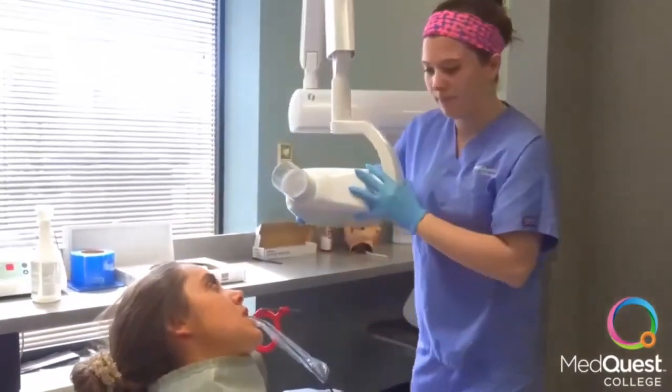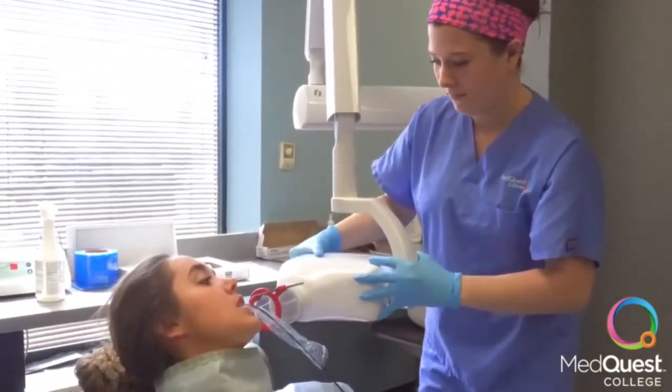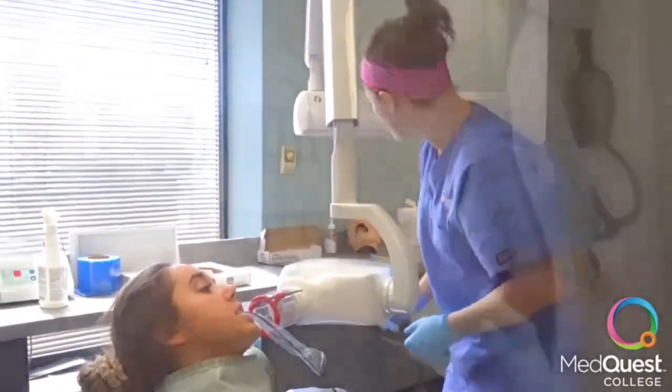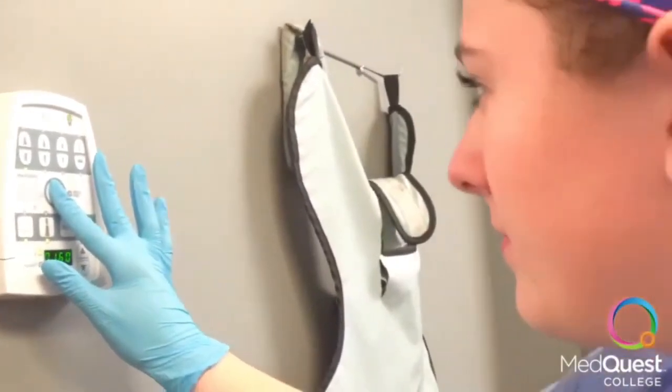Bite wing X-rays are commonly used to locate the source of tooth discomfort. Many modern dental offices don't use film anymore. Instead, they use a sensor, which sends the X-ray to a computer for review by the dentist. This makes the process a little faster because they don't have to develop the film.